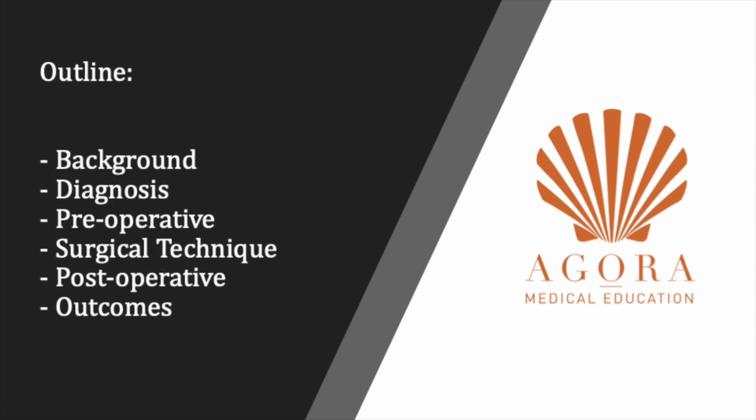This training video will cover the background of uterine septum, including the embryological development and the clinical implications, the diagnosis, including imaging modalities and timing, preoperative, including equipment required and surgical setup. Then we will discuss and show the step-by-step hysteroscopic transcervical resection technique and finish by outlining our routine post-operative care and outcomes.